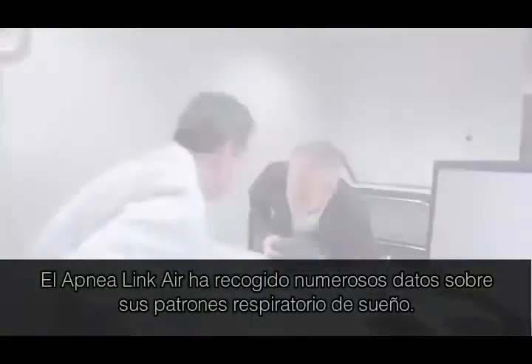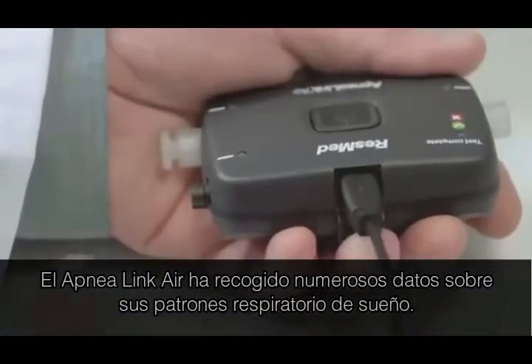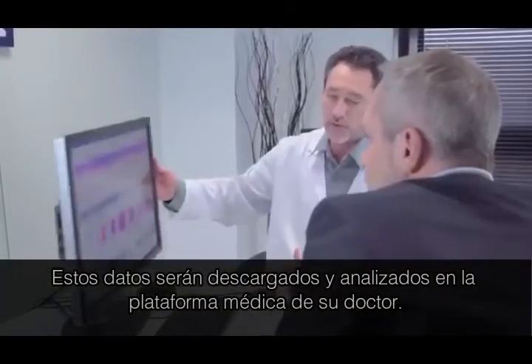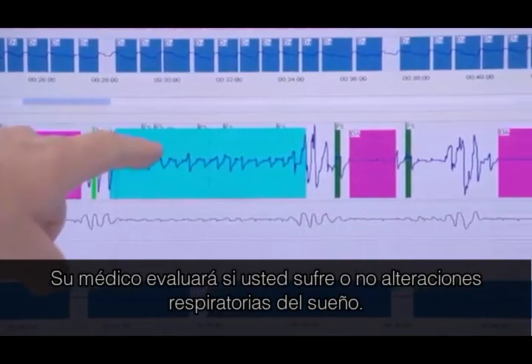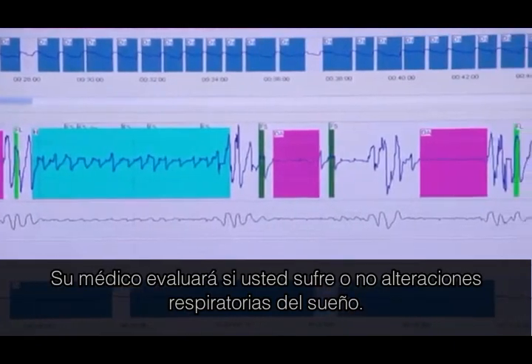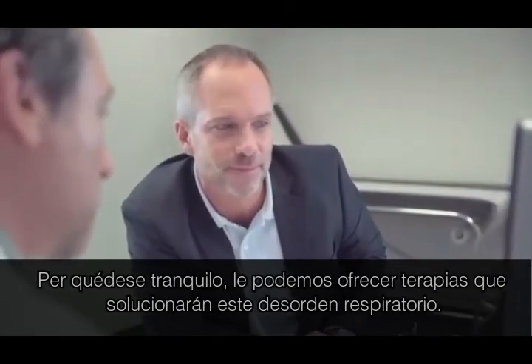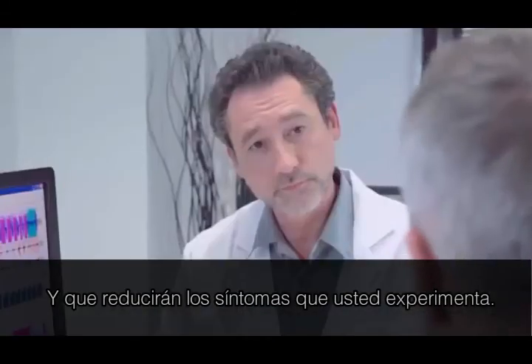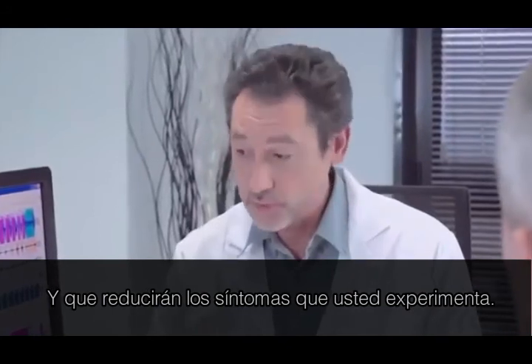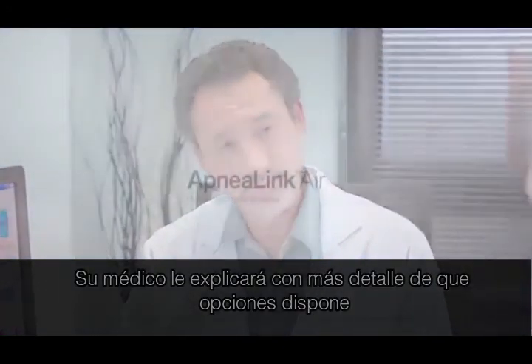The ApneaLink Air has now recorded a wealth of data about your sleep patterns. This data is downloaded and analyzed on your clinician's computer. Your clinician will be able to assess whether or not you are suffering from sleep disordered breathing. But rest assured, there are simple therapies that can be offered to treat these conditions and relieve you of the debilitating symptoms. Your clinician will happily tell you more on your options.